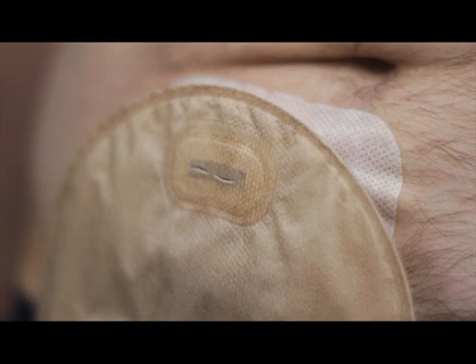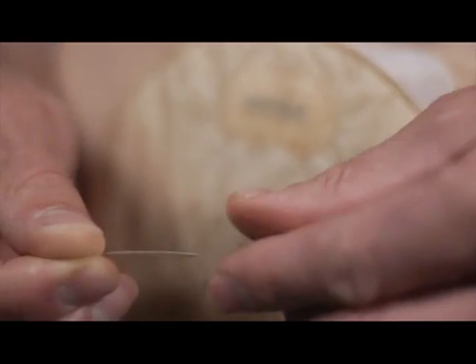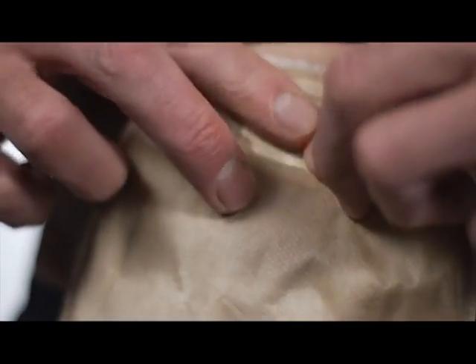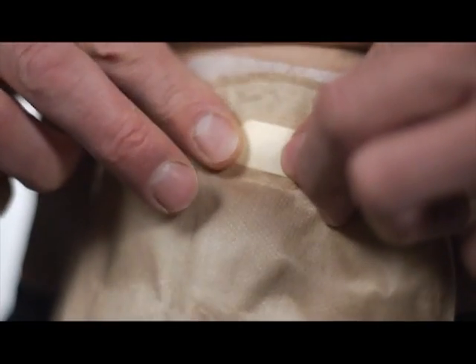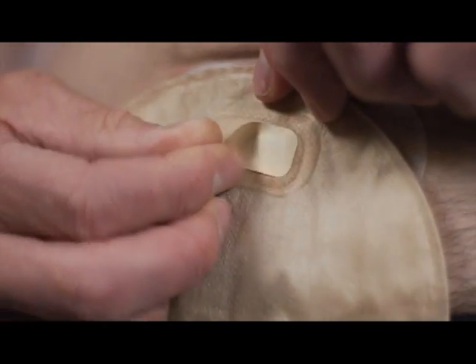Many ConvaTec pouches have an integrated charcoal filter designed to release and deodorize gas while preventing liquid from leaking through the pouch. The filter is located at the top of the pouch. Make sure to cover the filter opening with the filter covers provided in your package prior to any water activity such as bathing, showering, or swimming. Before removing the filter cover, make sure that the pouch is dry.